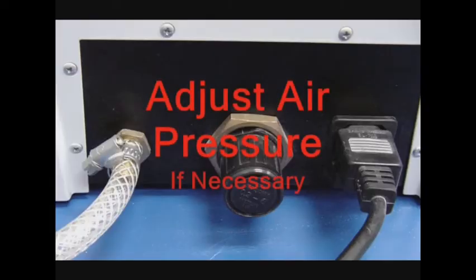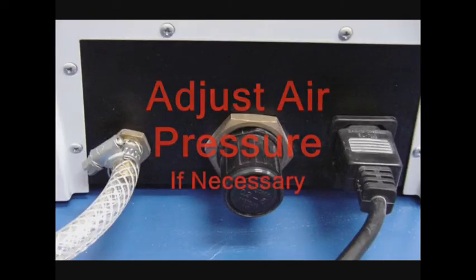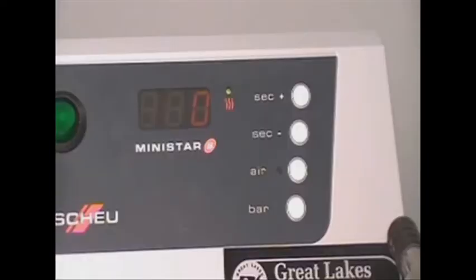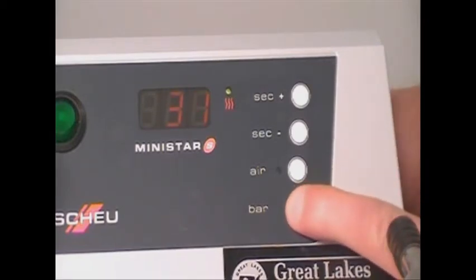The air pressure dial of the MiniStar is located on the back of the machine. Before adjusting the pressure through this dial, press the bar button to display the machine's pressure setting. Standard operating pressure should be set at 3 to 3.2 bar. Keep pressing the bar button when adjusting pressure.